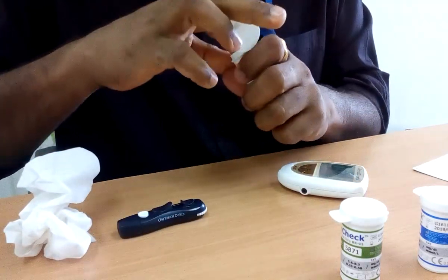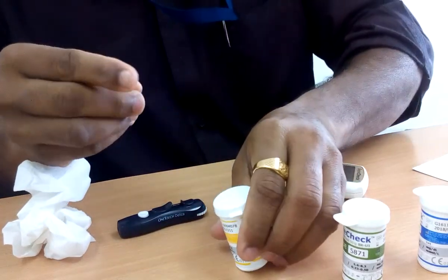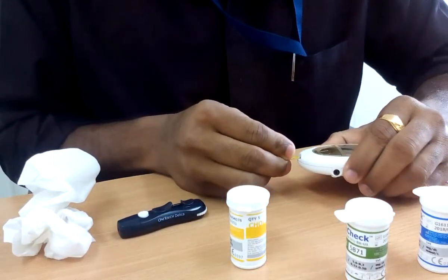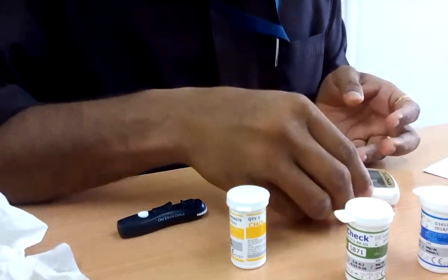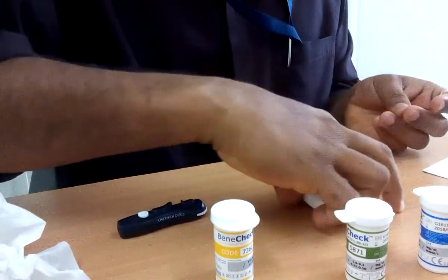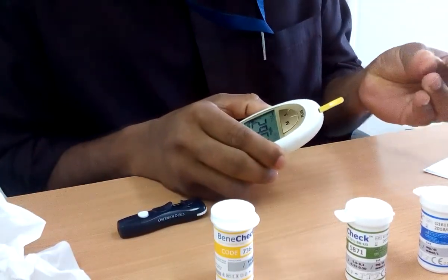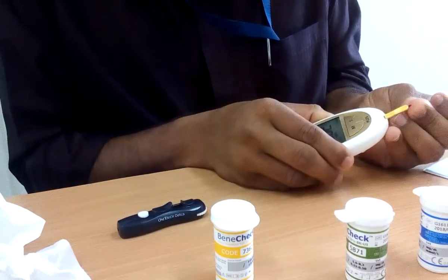Now for cholesterol — I think cholesterol may take a little time to get the result, not as fast as glucose and uric acid. The code number is 7362. I think cholesterol needs a little more blood sample.